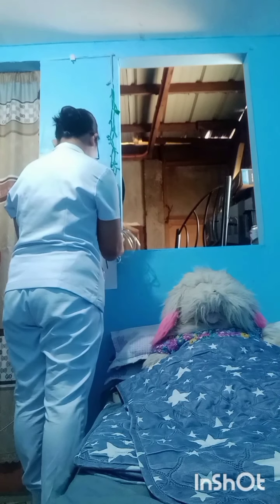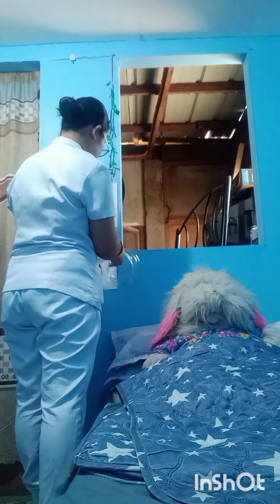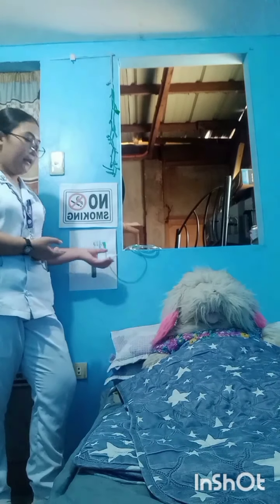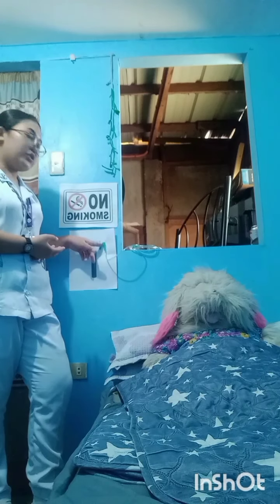So, tubing na na-paste ko na. Ito na. Ito na yung tubing natin, oxygen tubing na-attach ko na siya dito sa ating humidifier bottle.